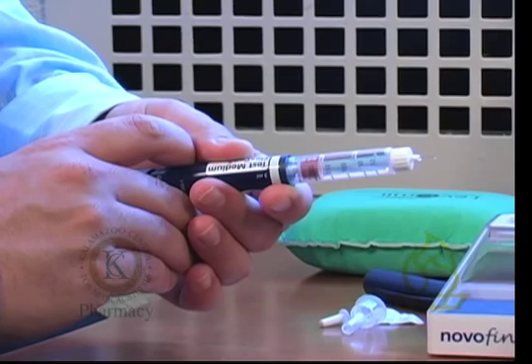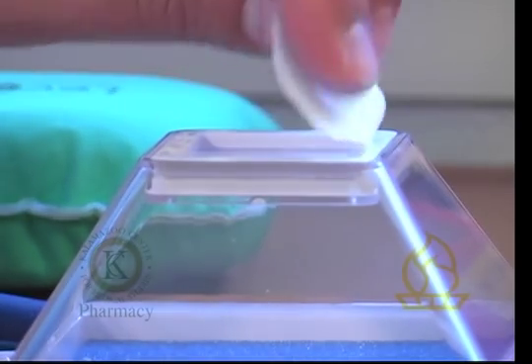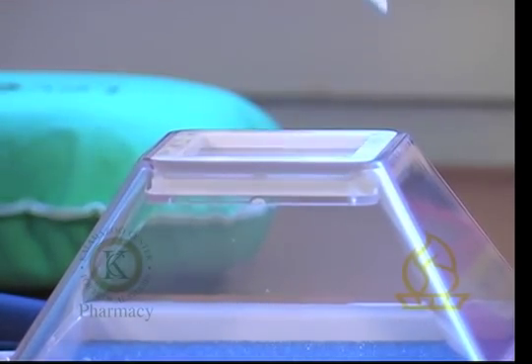Press the plunger to discharge the insulin, thus priming the device. Be sure to aim down. Prior to injecting, use an alcohol swab to clean the area you will be injecting into.